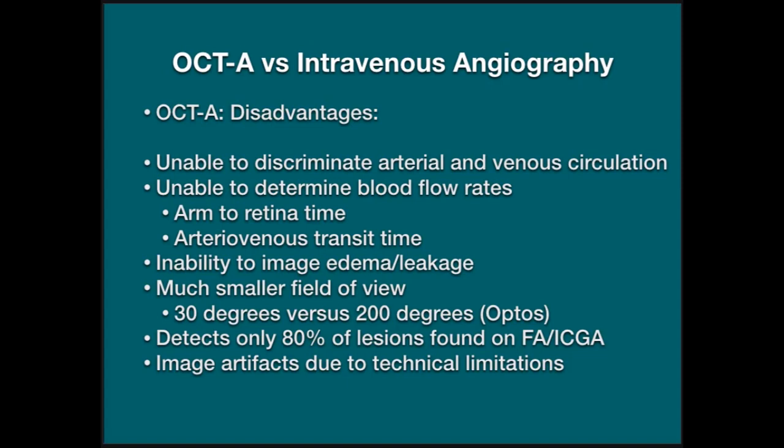With something like an Optos using their angiography system, you can do dye-based angiography out to 200 degrees. With OCT angiography, the most you can get is probably a 9x9mm scan, which gives you about 30 degrees of the fundus, so a much smaller field of view.